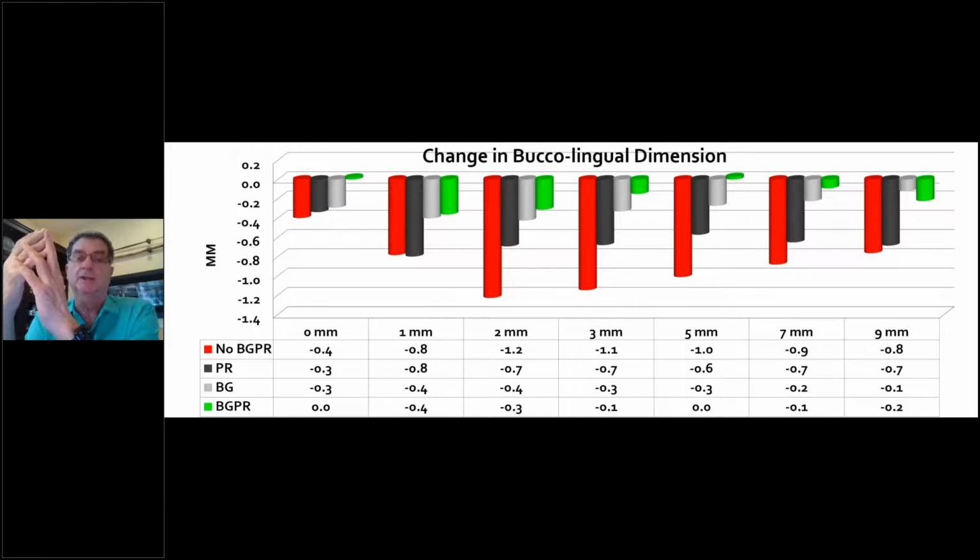And dual zone socket management to thicken the tissue, and that's what we saw. So this was really earth-shattering for us, but it shows you the evidence base as to what we do and why we do it. So we fill the gap for shape. It does not affect what's up against the implant.